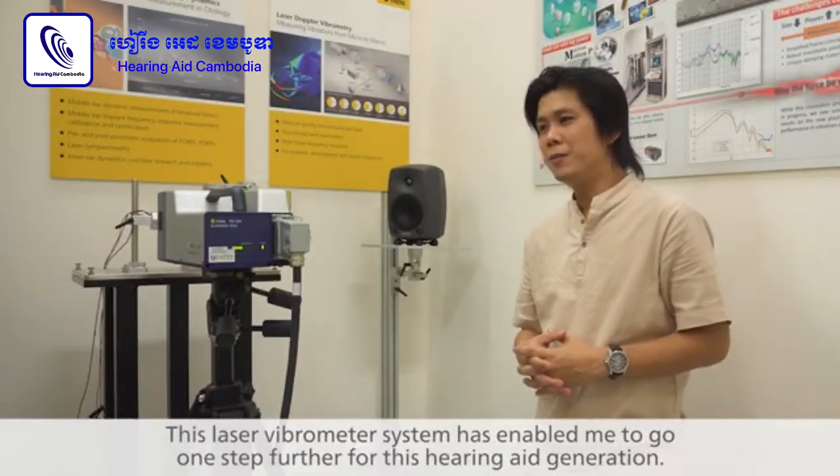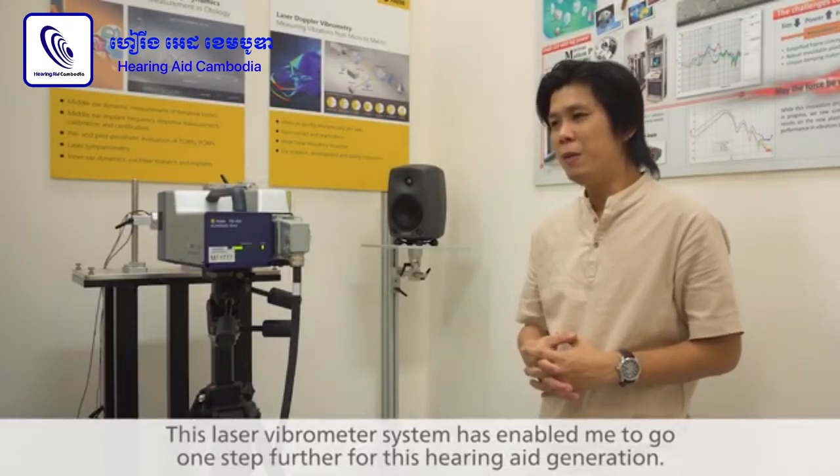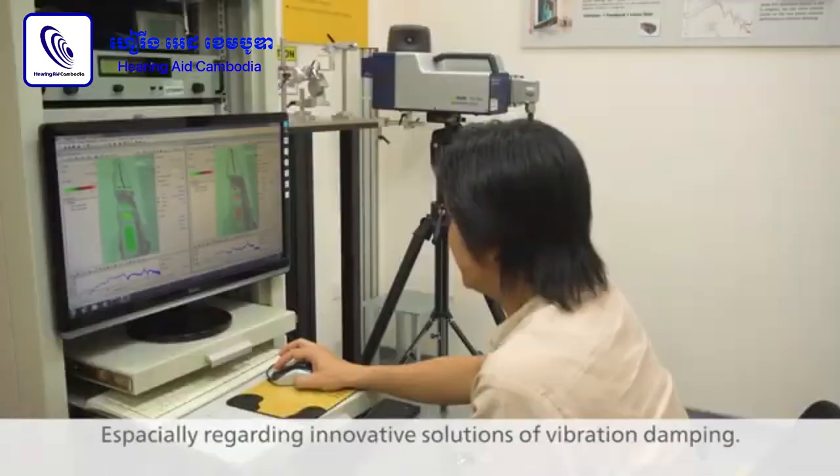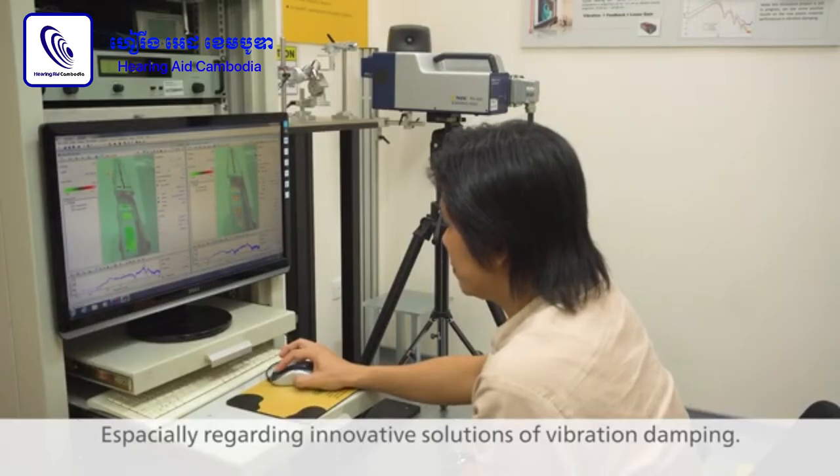With this laser vibrometer system, it has enabled me to go one step further in each generation of the hearing aids, especially when it comes to innovative solutions for damping in terms of vibration.